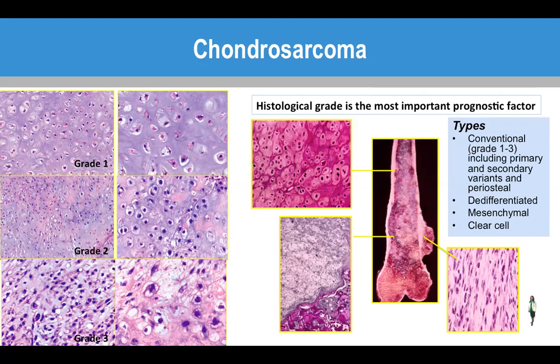That's also true for chondrosarcoma. And if you can see all that at medium power, that's grade 2. And if you have to examine it under high power, they are still not hypercellular, there's not much nuclear atypia, and that's pretty much grade 1.